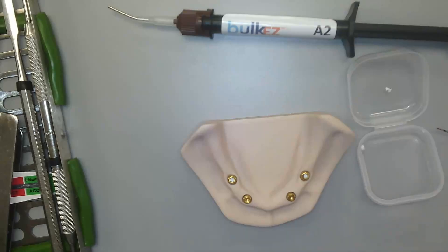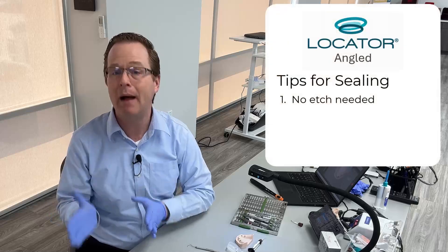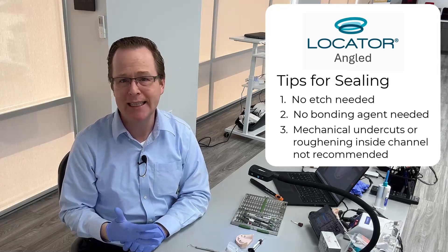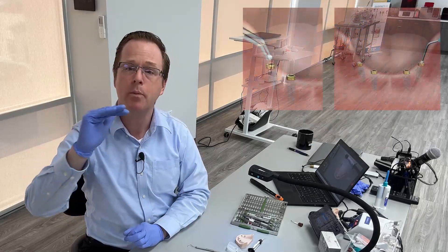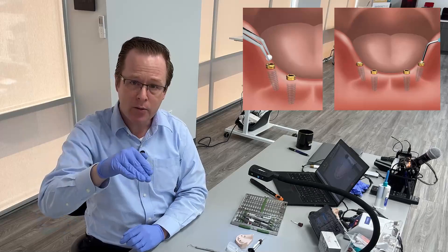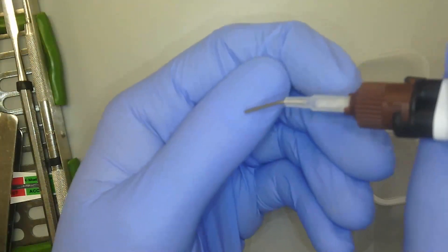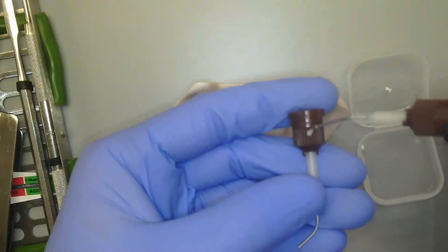Before I place my composite resin, we do not need to etch or bond for our locator angled abutment. I also don't need to add any mechanical retention on the inside of the locator angled cylindrical channel. The pellet goes in over the top of the screw, the abutment has been torqued, and then composite resin goes over the top. I'm going to take out my bulk easy material and verify that it flows out properly.